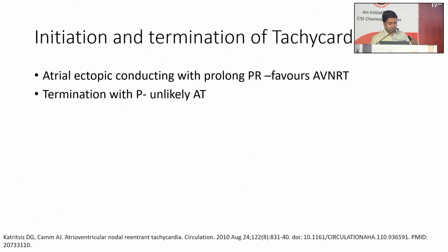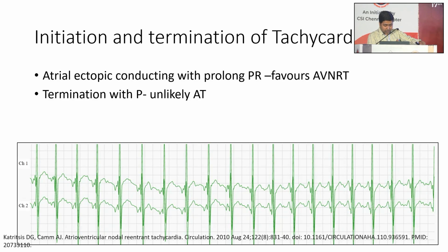Then termination. If any tachycardia terminates with a P, then it is unlikely to be AT, because the firing focus stopping as well as the AV node stopping at the same time is very unlikely. But if it is terminating with the QRS, then it can be anything.